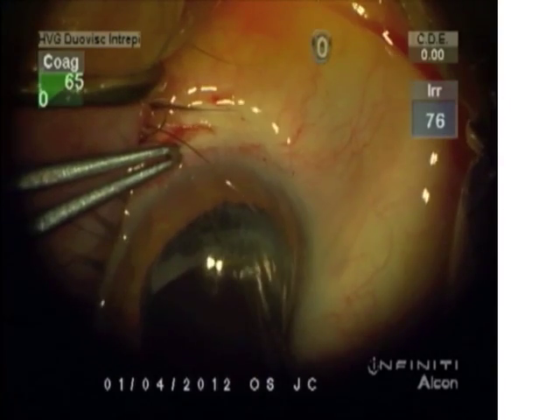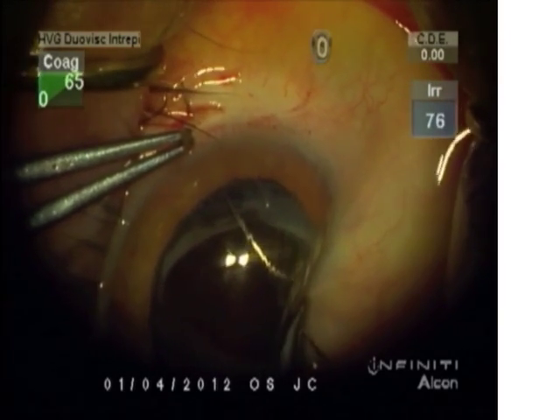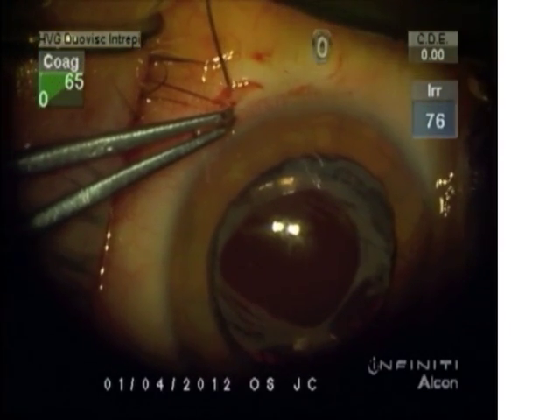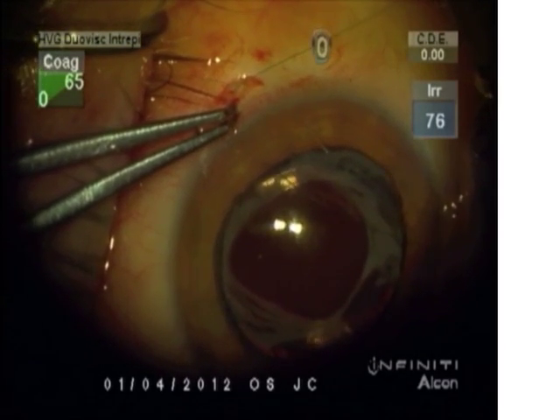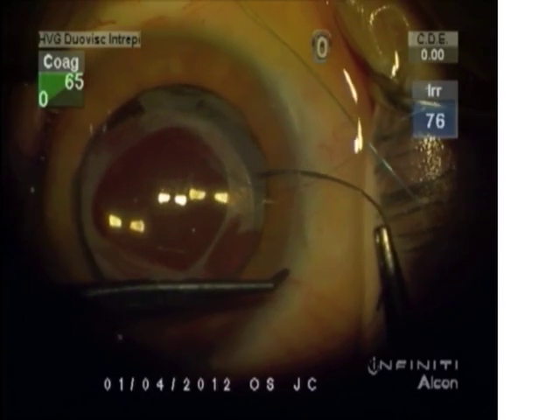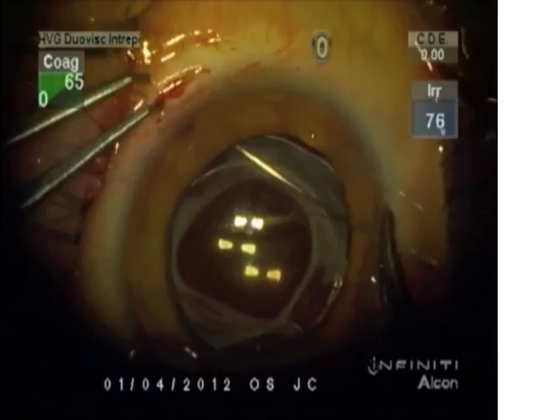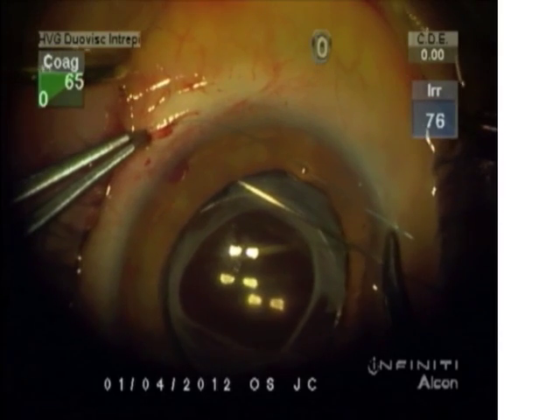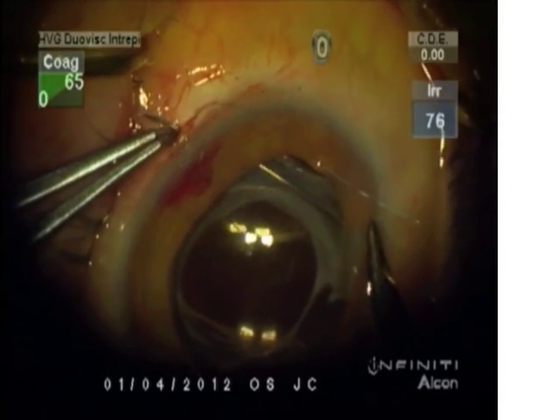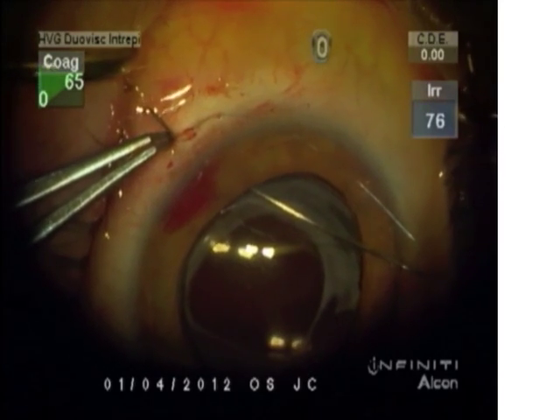The 9-O proline suture is brought now through the capsule membrane — that fibrotic membrane at the CCC — and out through the sclera. The second needle of the double-arm 9-O proline is passed above the capsule, out through the sulcus, and again through the sclera to refixate, stabilize, and re-center the capsule holding the intraocular lens.